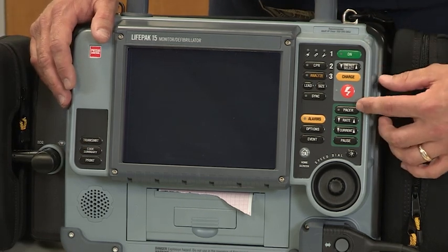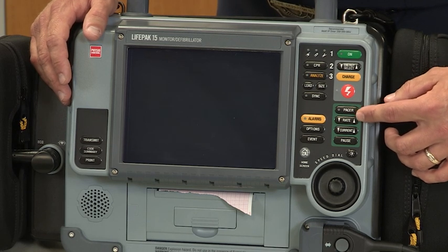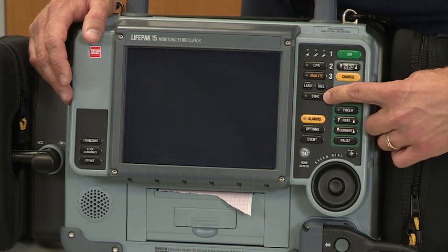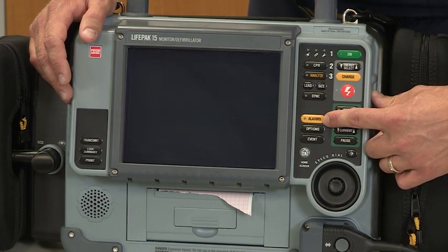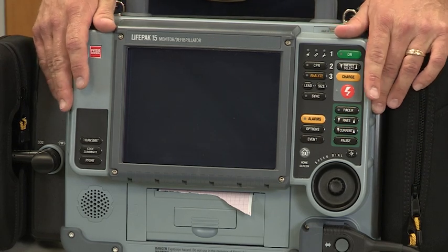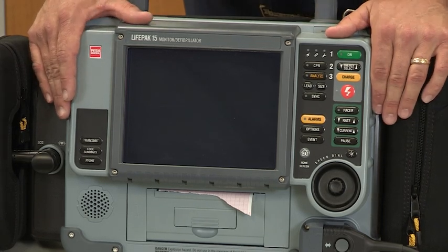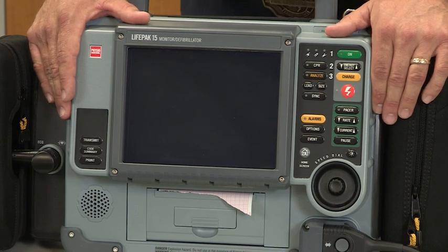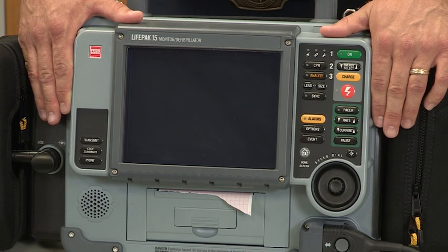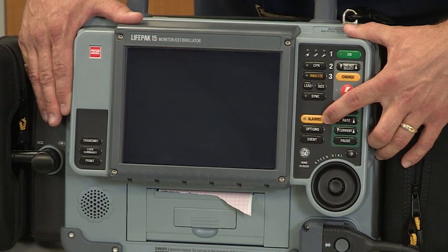Coming back over here to the other side, I pointed out earlier we've got the pacer feature. This is a feature that we are not going to use, along with the sync feature. And the alarms button will actually allow us to just go in and turn on an alarm whenever the patient goes into VF or VTAC. Automatically it'll alarm and notify us to check the patient. However, due to our ROC protocol of 2 continuous minutes of CPR and then analyzing the patient, we're not going to use that alarms feature and it's actually turned off.